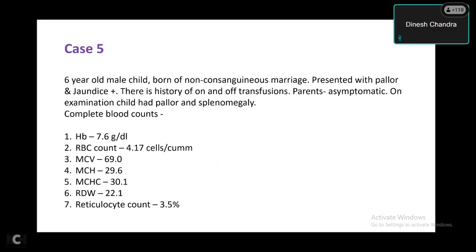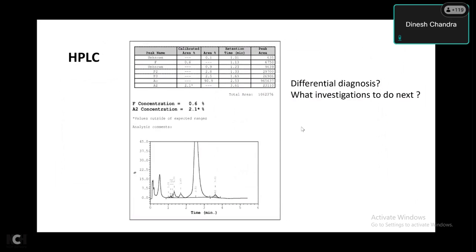Ma'am, can you go back to the graph again? Go to the graph again. Yeah. Okay, so what is unusual that you have not seen in previous graphs? Pre-integration, anything unusual you have seen over here? Bilirubin, yes. Who said that? Sarangi? No. Who answered? Bilirubin peak. Okay, there is a bilirubin peak you can say, but who said pre-integration peak?